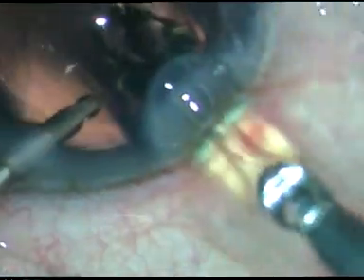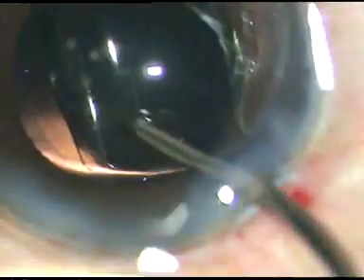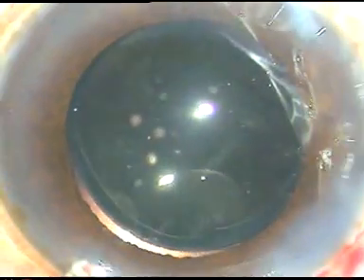Now very nice cleaning of the cortex; the posterior capsule looks clean. This is how a hydrophilic acrylic — or hydrophobic acrylic — intraocular lens can be implanted under irrigation. The irrigating probe supports the optic and sends the trailing haptic into the capsular bag. Now the side ports are hydrated.